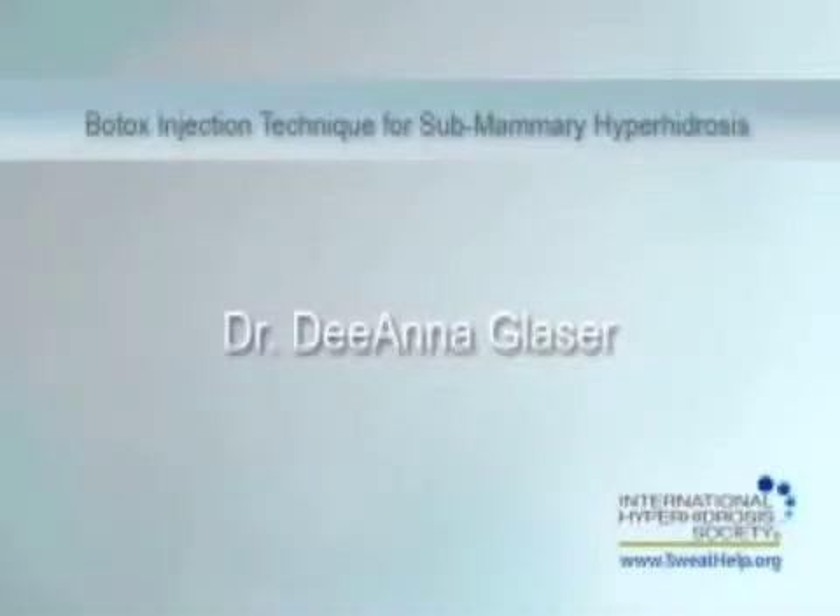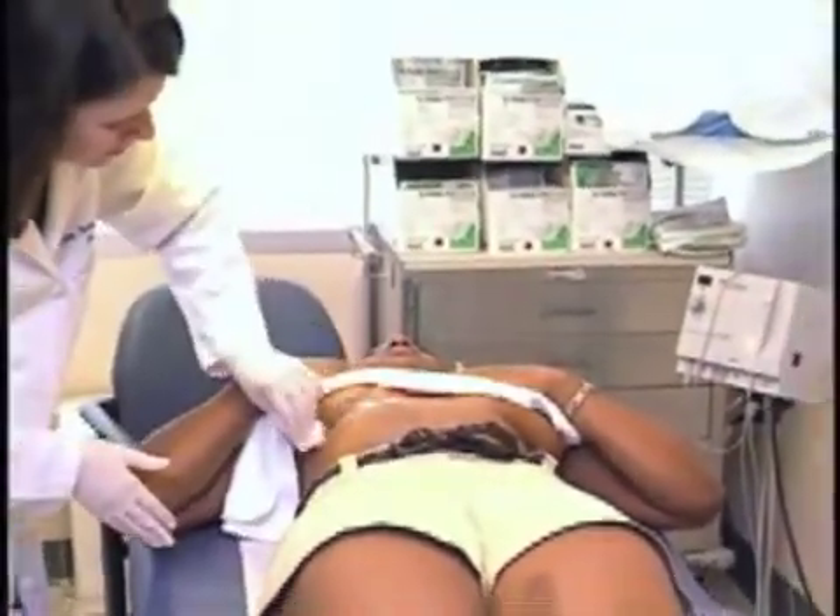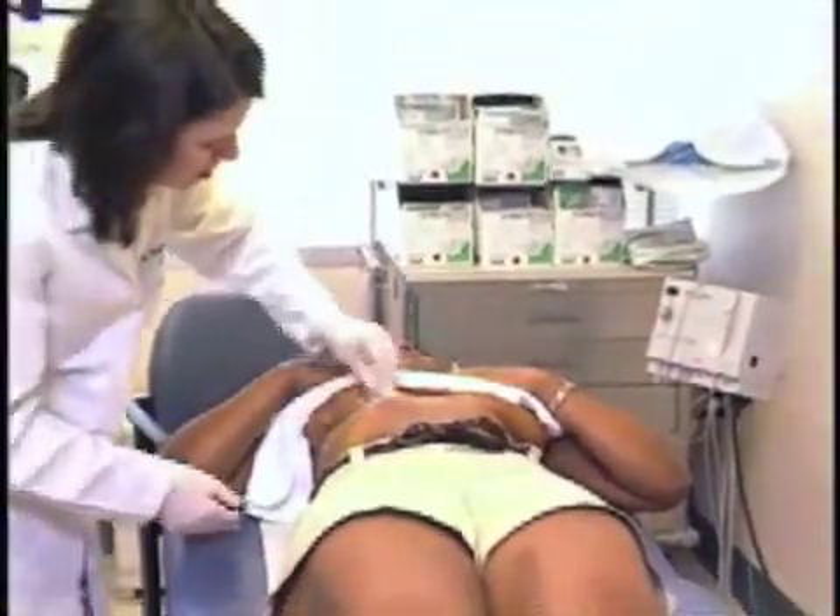On behalf of the International Hyperhidrosis Society, Dr. Deanna Glazer will demonstrate the Botox injection technique for submammary hyperhidrosis. A starch iodine test should be done to determine the area of sweating. If the test reveals nothing, the physician will have to inject the area the patient thinks the perspiration is coming from.